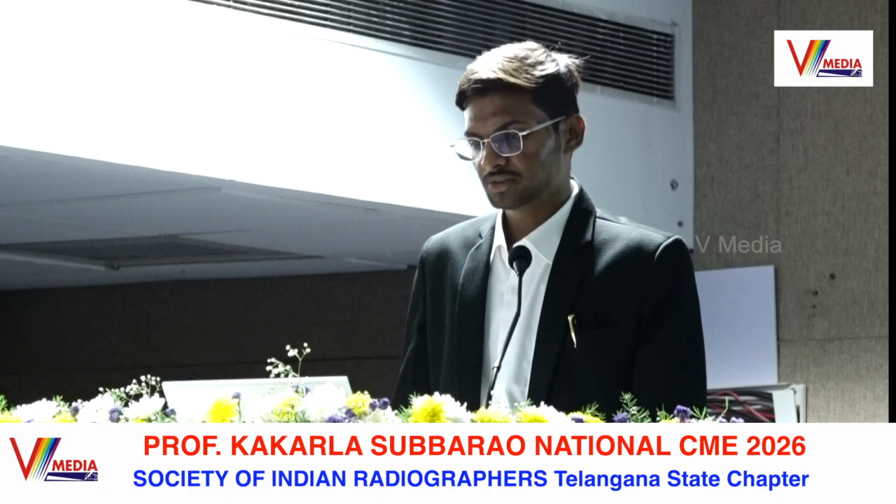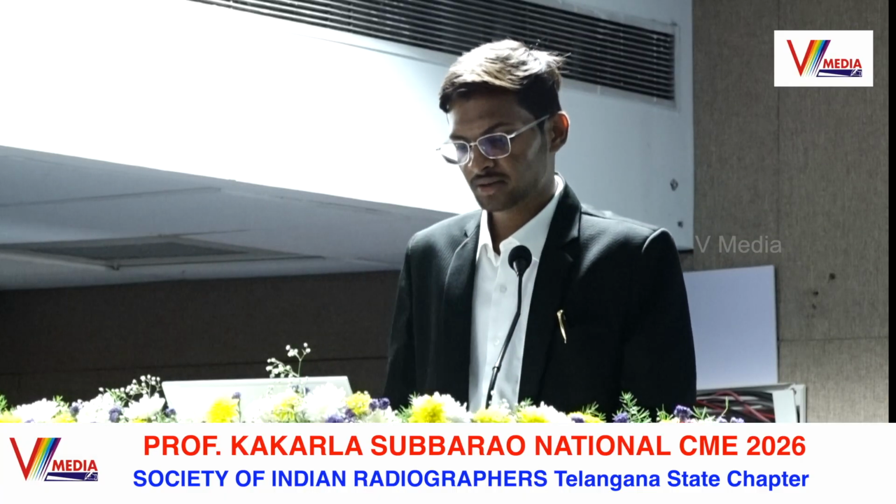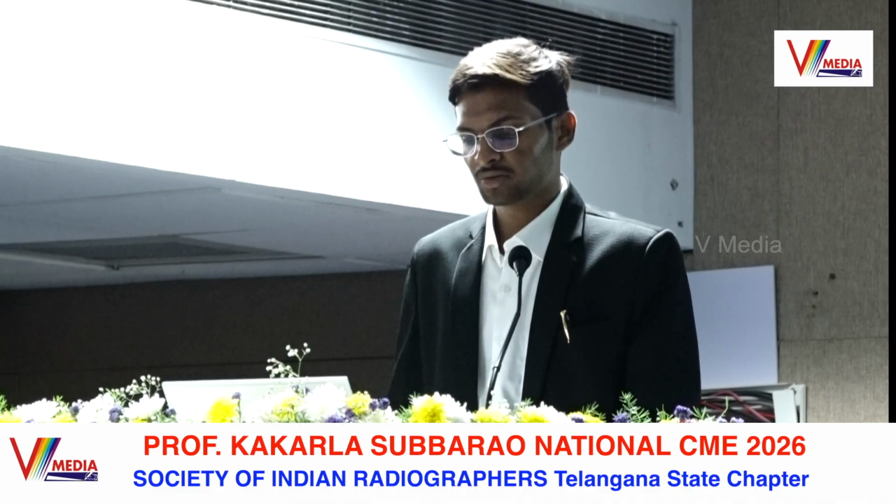The disadvantages are radiation exposure and the risk of contrast injection. These are the radiation protection measures. We follow the ALARA principle, dose optimization, and patient and staff safety. AI in radiology will involve deep learning modalities, automatic reconstruction, patient flow, slice thickness, and automatic parameters. Conclusion: CT angiography is an effective modality.